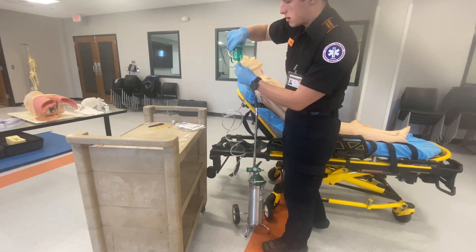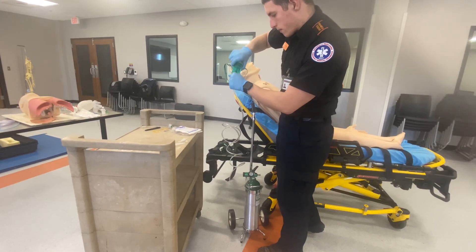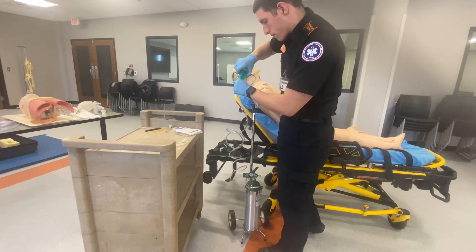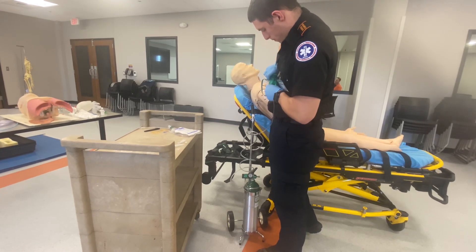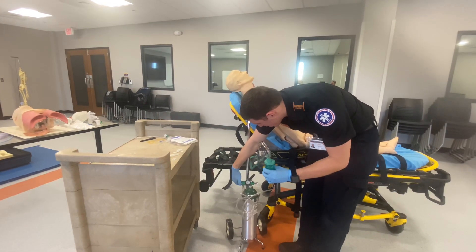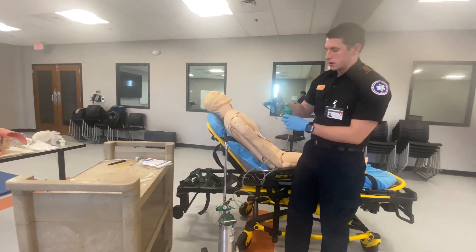I'm going to be putting this tubing in here. I'm going to set this to 8 liters per minute for proper nebulization.